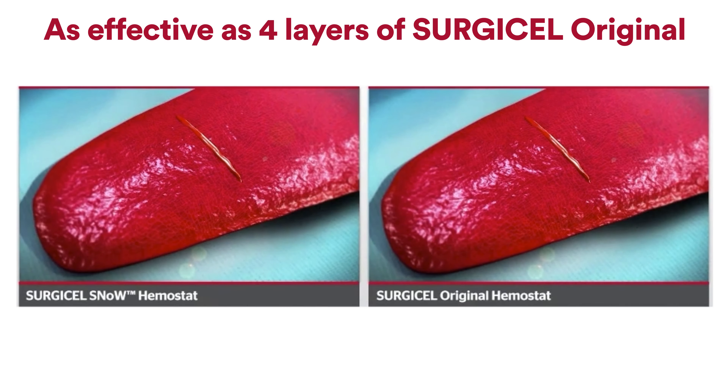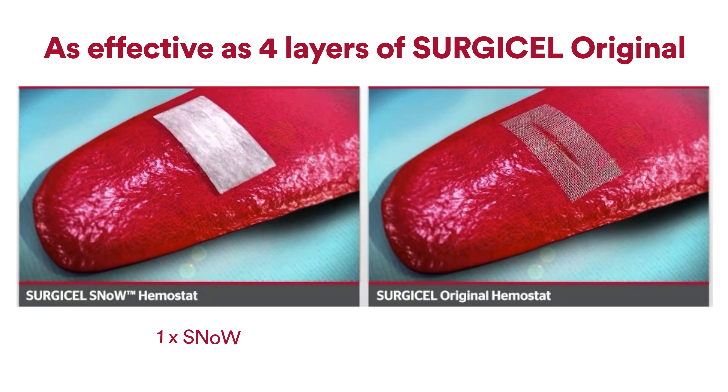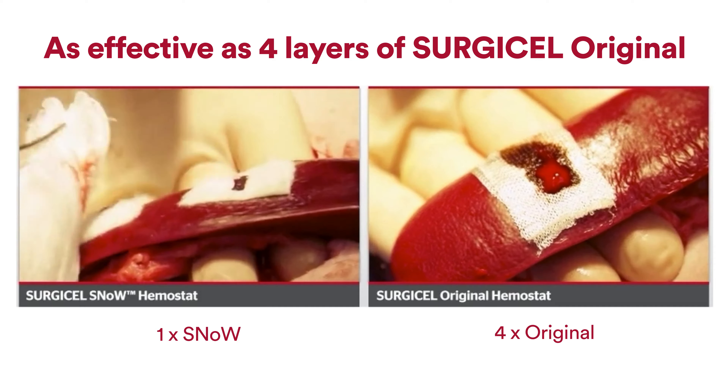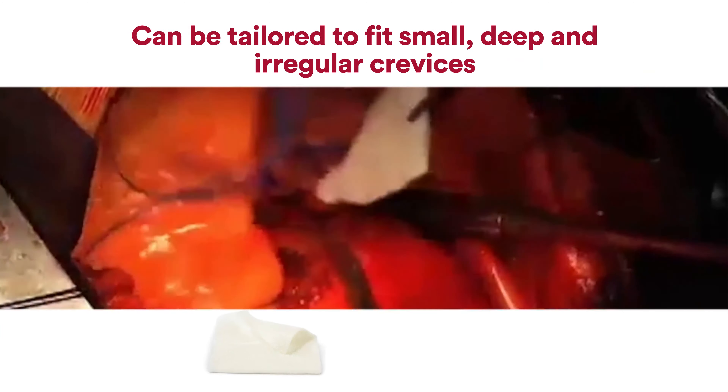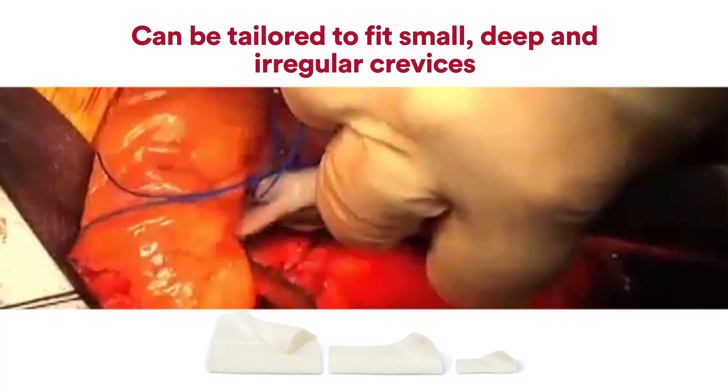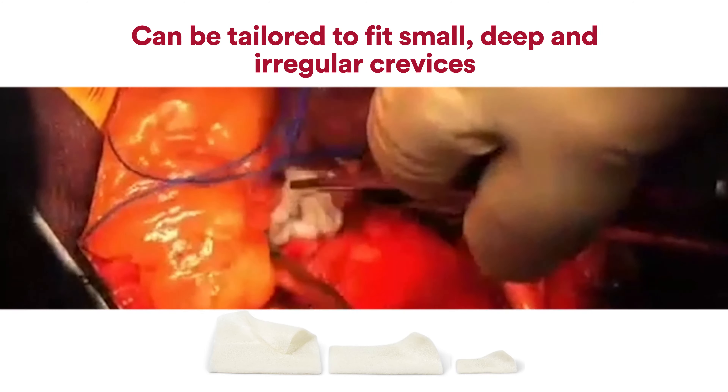As effective as four layers of Surgicel Original, the felt-like fabric is lightweight, drapable and able to hold a stitch. This can easily be tailored to a size or shape that fits into small, deep and irregular crevices during laparoscopic procedures.